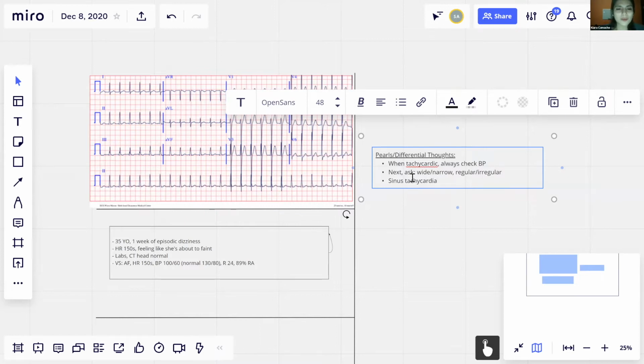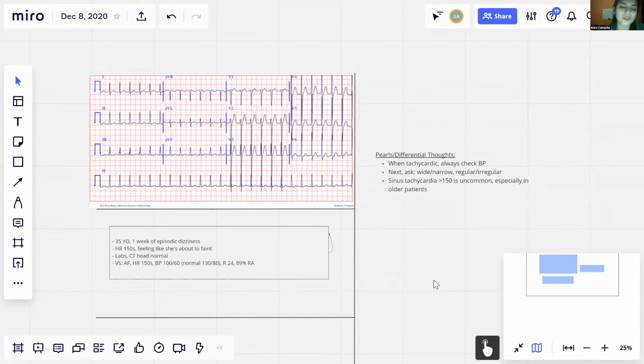First, looking at the EKG again, I see a very big QRS complex through V2 to V6, and I'm thinking of left ventricular hypertrophy. And what I'm thinking is, what pathology can be causing this left ventricular hypertrophy? With a very young patient with pre-syncope and chest pain, I'm really thinking about some sort of pulmonary hypertension, either a pulmonary cause or a cardiac cause.